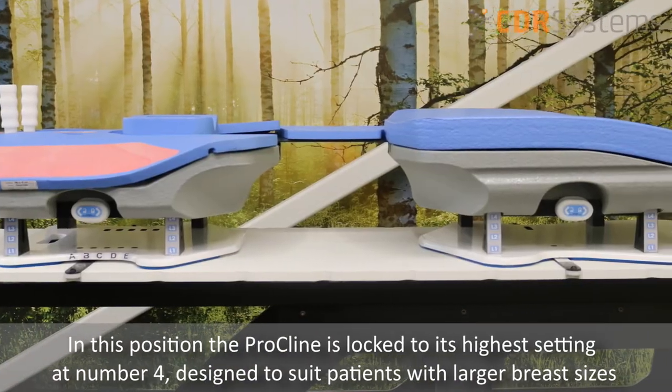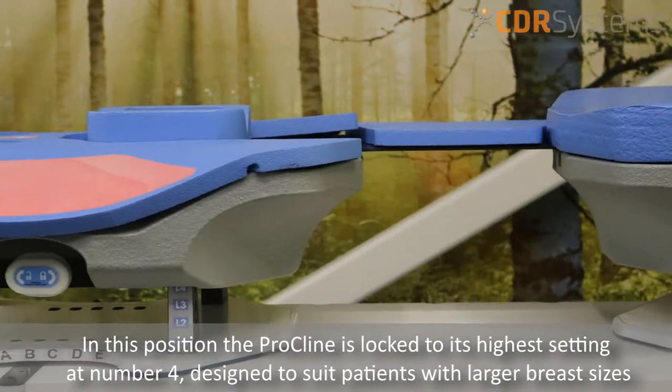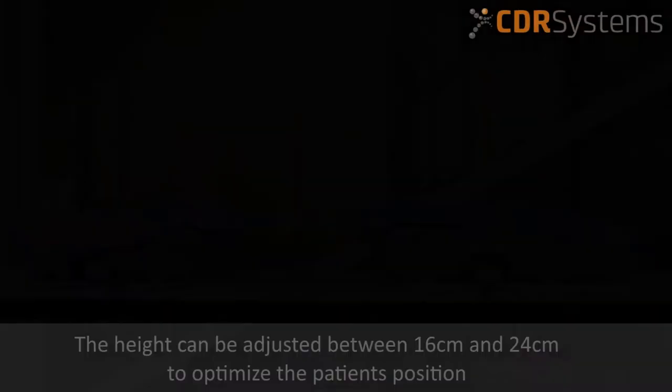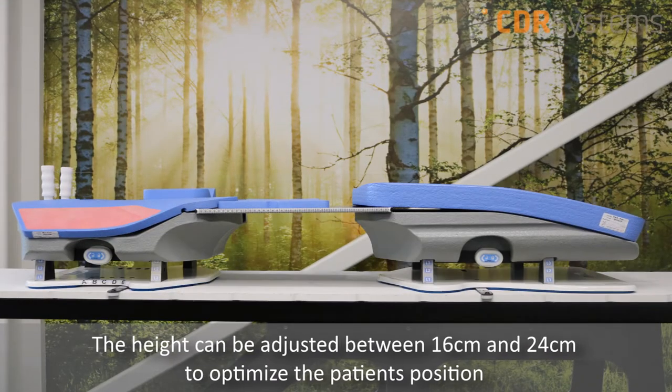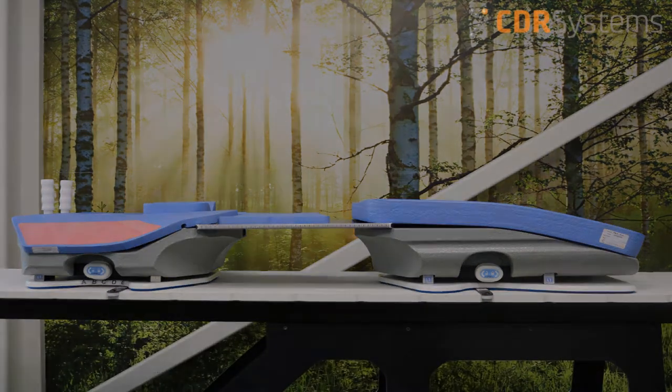In this position, the Procline is locked to its highest setting at number four, designed to suit patients with larger breast sizes. The height can be adjusted between 16 centimeters and 24 centimeters to optimize the patient's position.